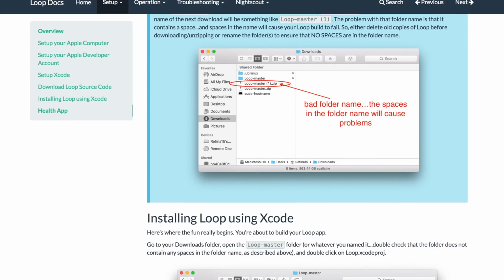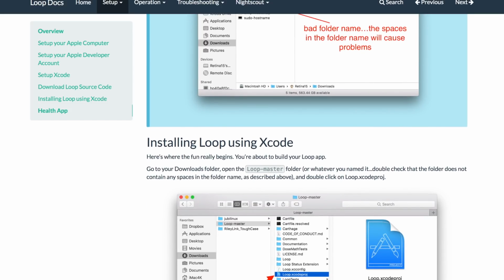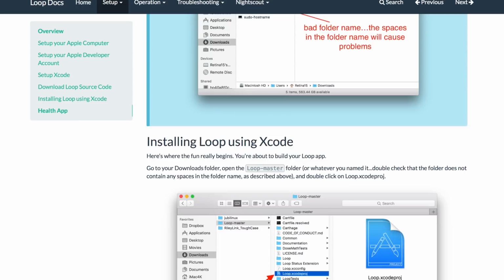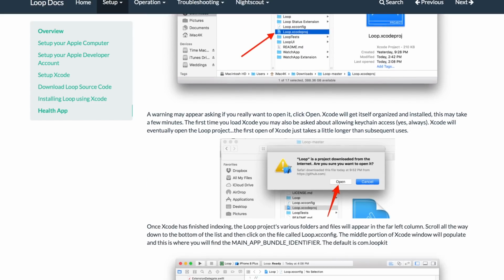And in my opinion, in the system that I'm using, Loop, there's almost no tech, no admin involved. If you have no IT experience, no coding experience, you can really do Loop. If you do decide to use something like OpenAPS and Android APS, those instructions are just next level.